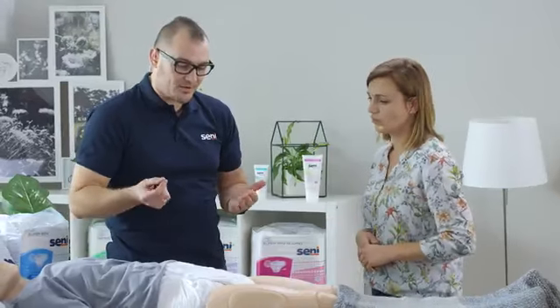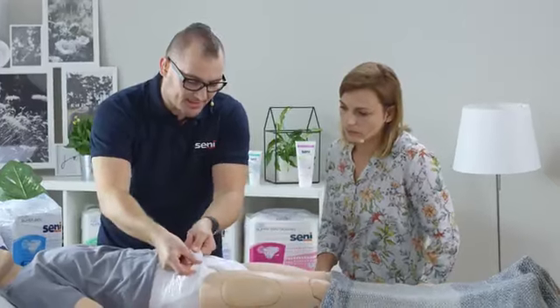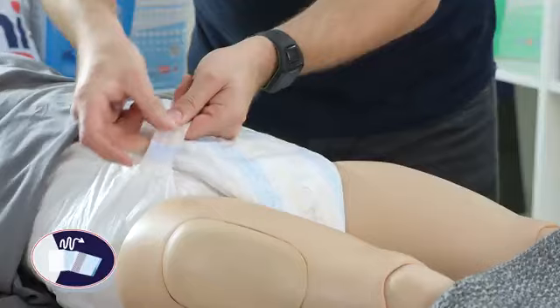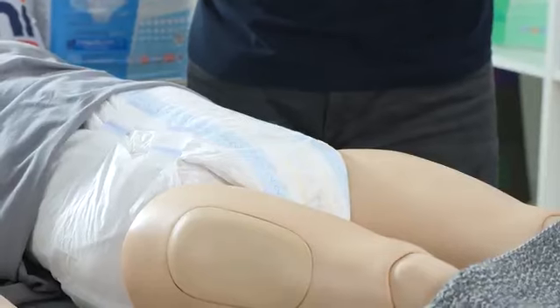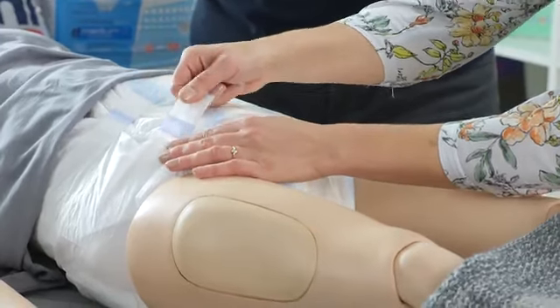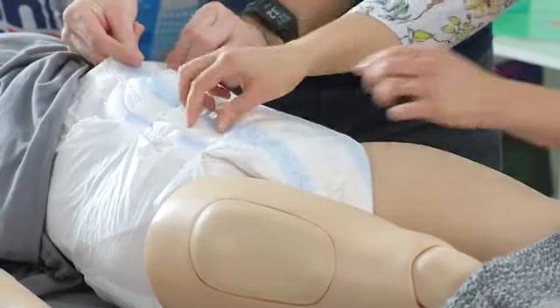The product must be comfortable for our patient. We talked about skin comfort and breathability, but the elastic element is also very important. Please have a look. Here we have a special system for elastic combi tape fasteners. We have a special flexibility system that allows excellent fit of this product. It does not compress the patient, but still allows to adhere closely to the body, because the closer such a product adheres to the body, the lower the risk of leakage. Indeed.